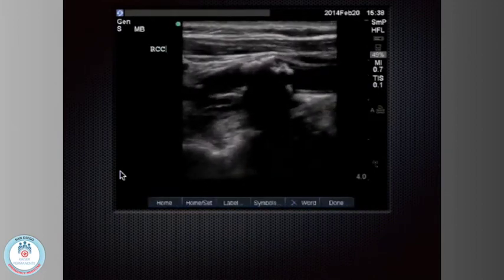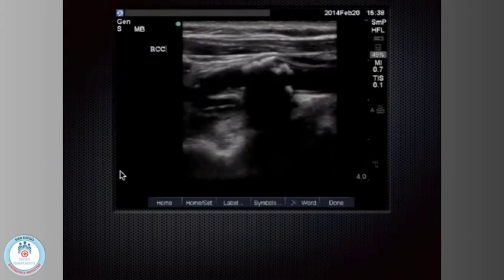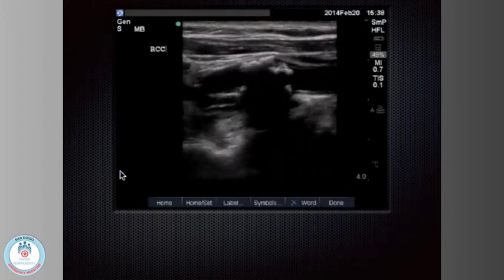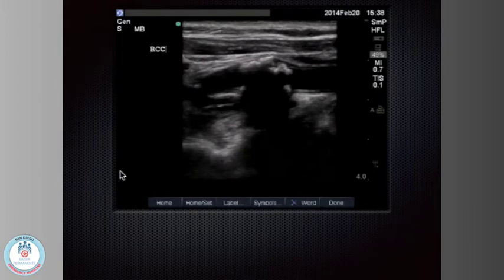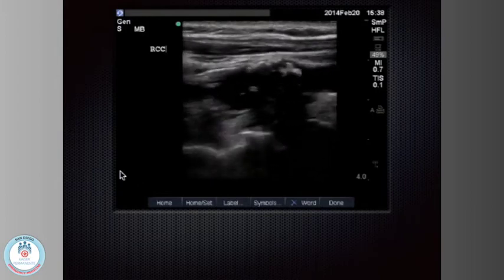And then, what about this? I wouldn't expect you to know what this is except for the initials on the screen. RCC. The right common carotid. This is somebody having stroke symptoms. For fun, I looked at their carotid artery and I just saw tons of plaque up there. That's just all plaque in the carotid artery on the way towards the brain.